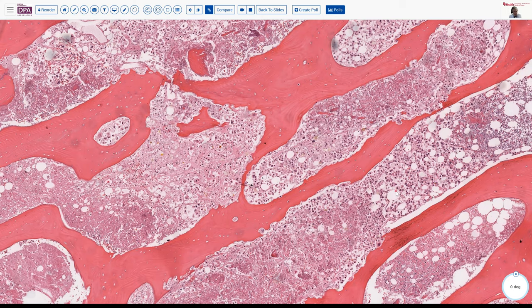And so considering whether or not you may want to use EDTA as a partial decalcification procedure if you're going to have to do immunohistochemistry is a valid consideration. If you only have access to acid decalcification, then you may have to look at doing a variety of validation studies and optimizing your immunohistochemistry processes so that you can rely upon those answers.